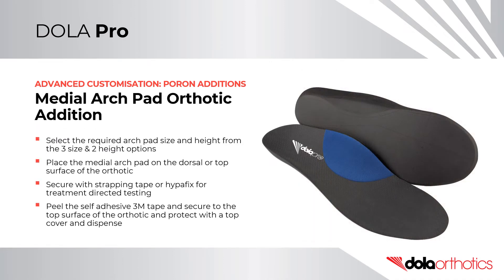For medial arch pad orthotic addition, select the required arch pad size and height and place the medial arch pad on the dorsal surface of the orthotic. Secure with strapping tape or Hypafix for treatment-directed testing, or peel and stick with the self-adhesive 3M tape for orthotic manufacture. Protect the Poron arch pad with a top cover for long-term use and dispense.